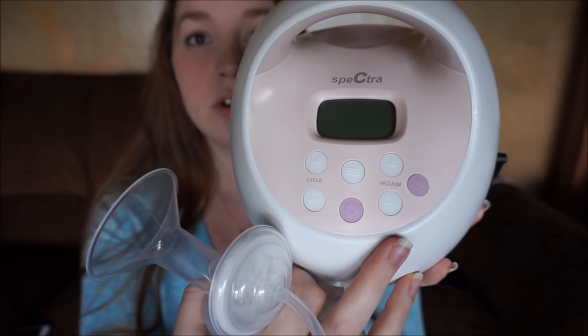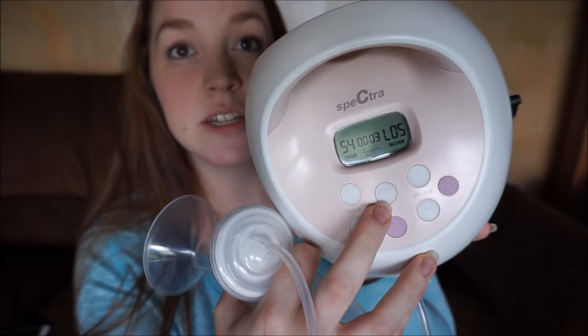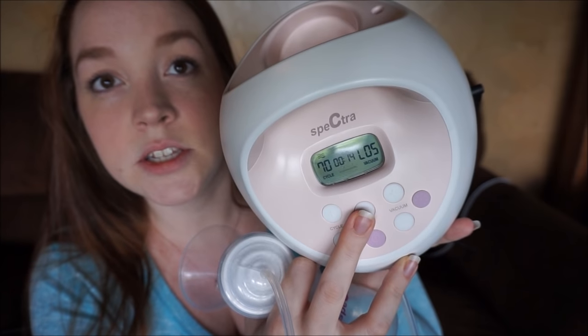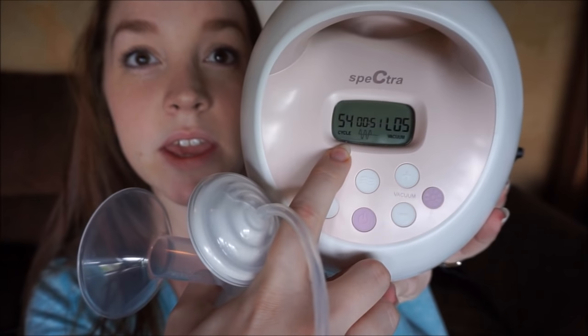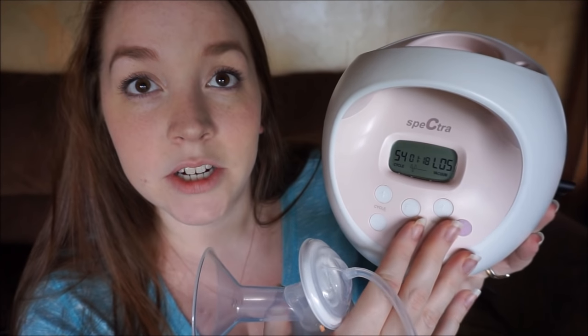Over here is where you control your cycles and over here is where you control your vacuum. The cycles control how fast or slow it goes, and the vacuum controls how strong or soft the suction is. There's also a really easy button to go back and forth between expression and stimulation mode. The higher the numbers go, the faster and more suction; the lower they go, the slower and less suction.